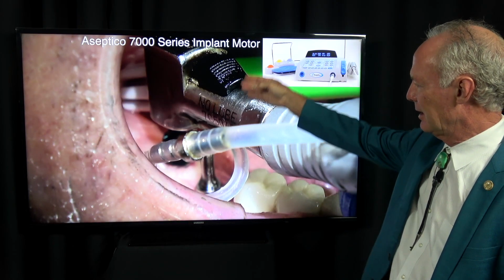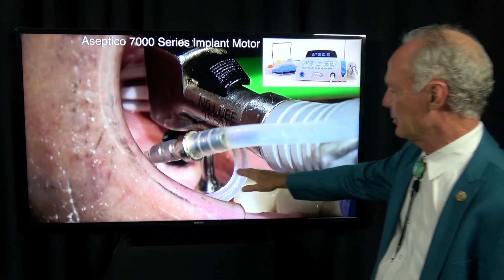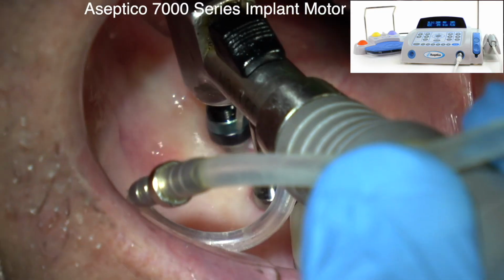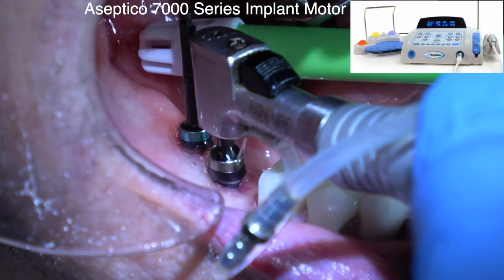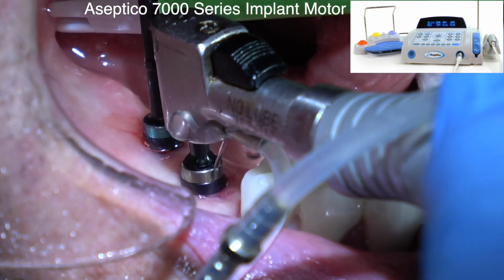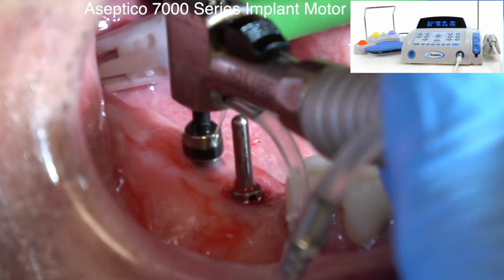And you can see how now you can go pretty quickly. That drill just drops into the osteotomy and is stopped on the soft tissue by the shoulder. Makes it very quick, very easy. You can put some good pressure on the tissue because the tissue is going to stop the shoulder. So now I'm up to a 4.1 drill. I've got 2 drills in here now to measure. Here we go. They were pretty parallel.